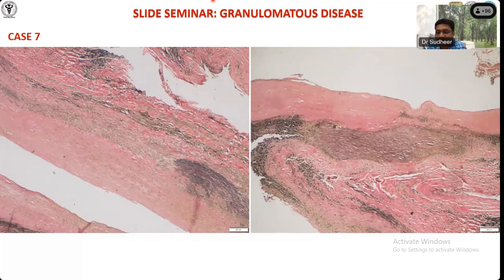Okay, again, few more pictures. Can you see? These are maintained medial elastic fibers, and the inflammation is there at the periphery. Part of the elastic structure is maintained, but here it's totally lost. Now the mucin stain, yeah? Mucin deposition also aggravates this.